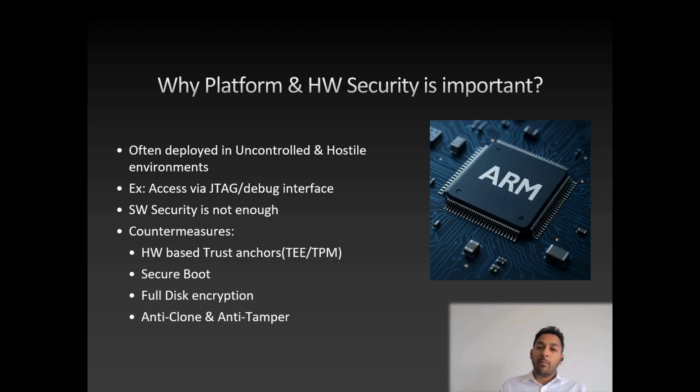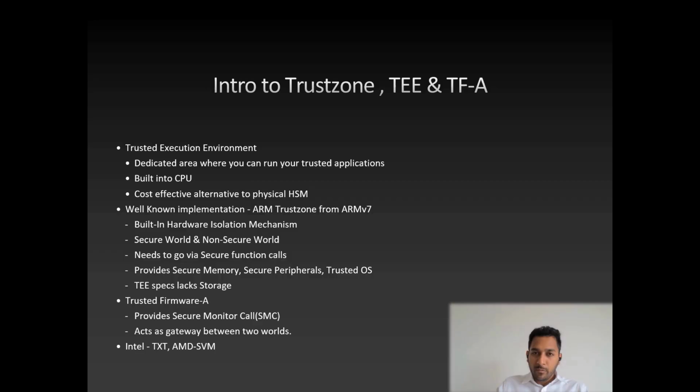It also enables you to have secure boot. Basically, you are making sure you are loading only trusted modules and firmwares once the device boots. So that's what secure boot provides. TPM or TEE also enables you to have full disk encryption that protects against offline attacks. You can also have anti-clone, anti-tamper properties to protect against these kinds of attacks.